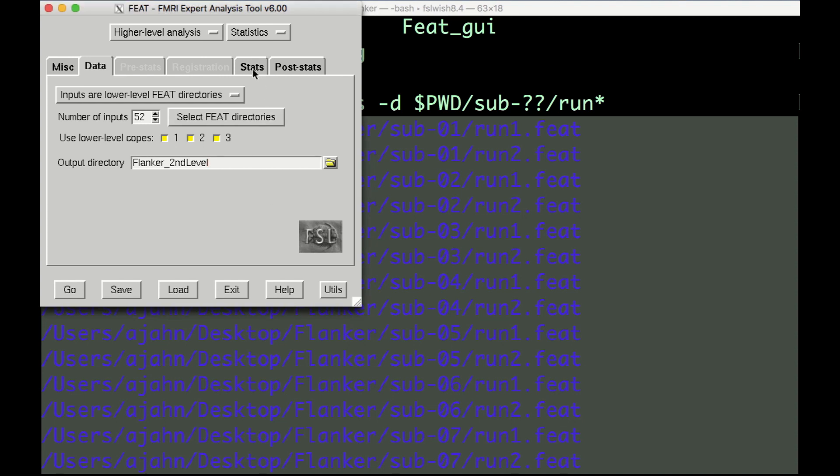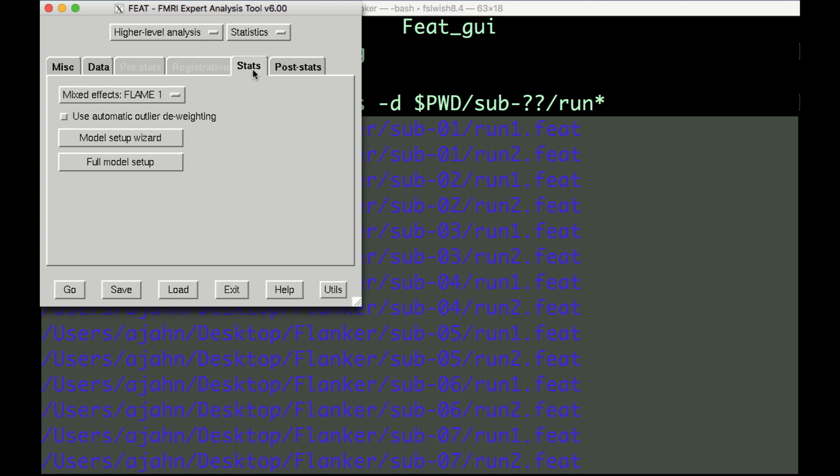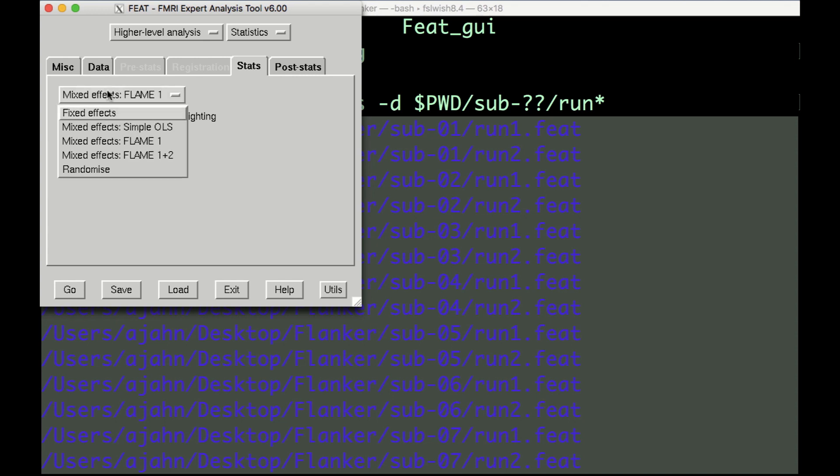The Stats tab will look different from when you used it for first-level analysis. You can now choose between different types of inference, or how you want the results to generalize to the population. The drop-down menu has the following options, which are discussed more in the book chapter down below.